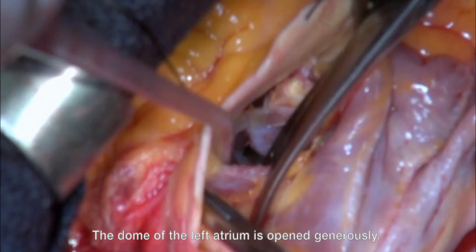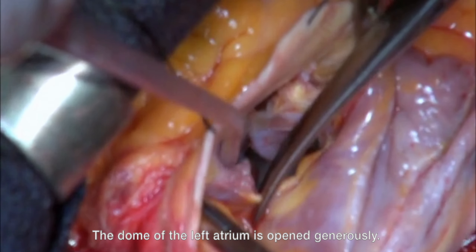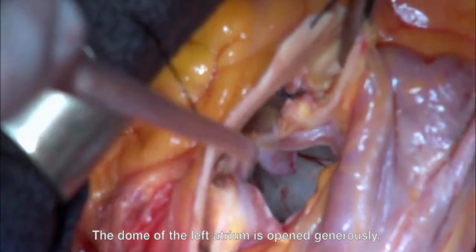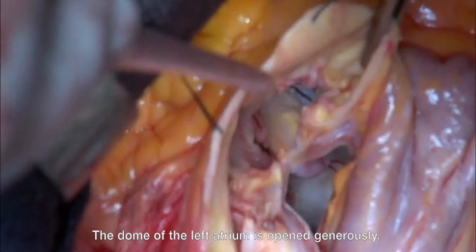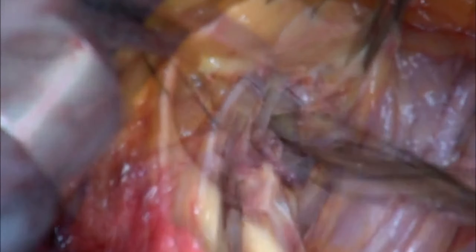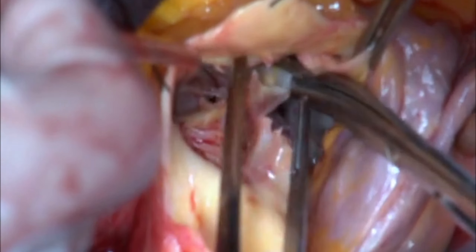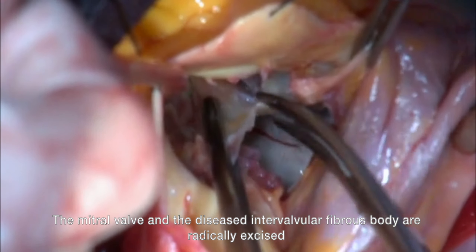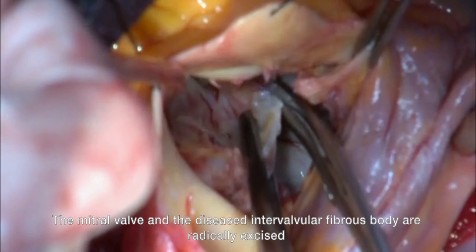The extensiveness of the resection and reconstruction in cases of endocarditis depends on the degree to which the neighboring tissues are involved by the infectious process.